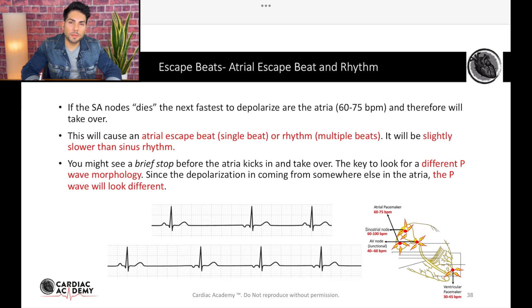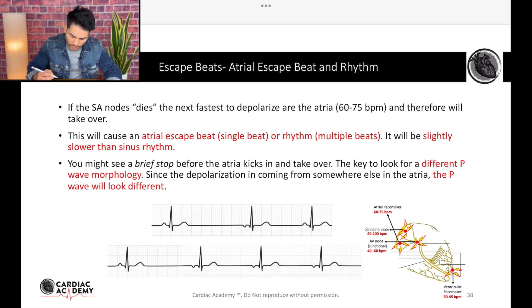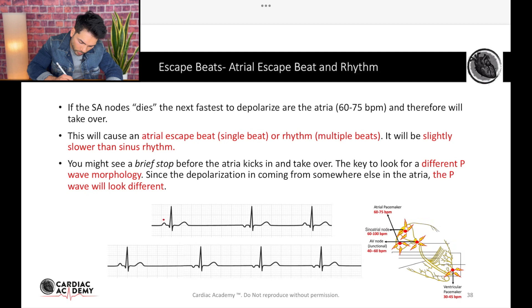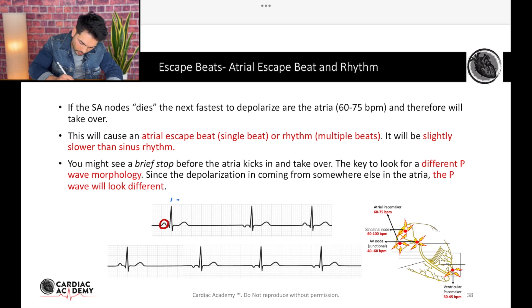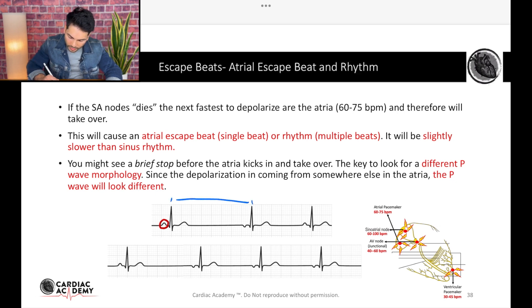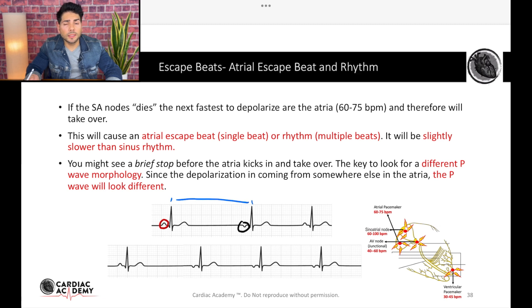Let's go into each one of them. First, we're going to discuss an atrial escape beat versus an atrial escape rhythm. If the SA node stops firing, then the second fastest one is going to take over. Here we can see a normal P wave, generated at the SA node. Then we see a pause, and then we see a new P wave pop up. This P wave is different from the previous one, meaning that depolarization is being originated from somewhere else in the atria — still at the level of the atria, but not at the SA node.